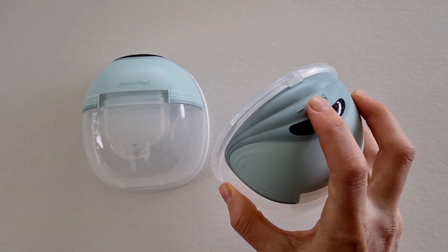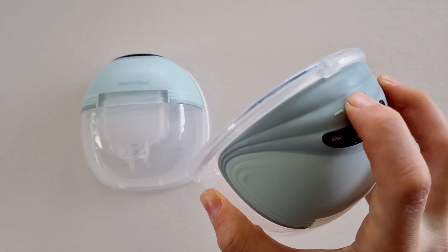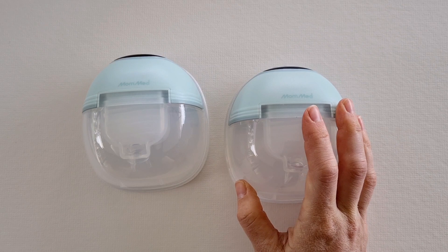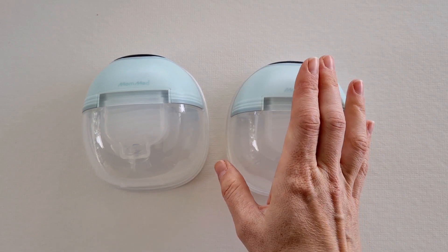In terms of noise level, if I turn it on you can hear it's really quite quiet. This is great, but keep in mind if you're in a really silent workplace you may notice that the pump is running. If there's a little bit of background noise, it is going to be very discreet.